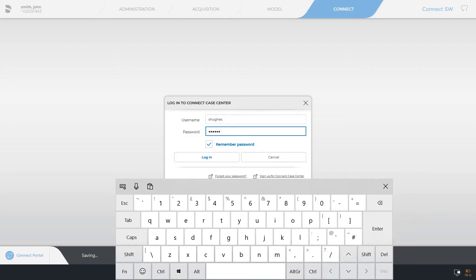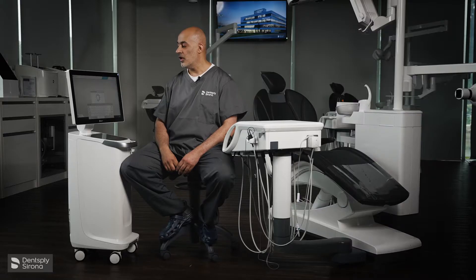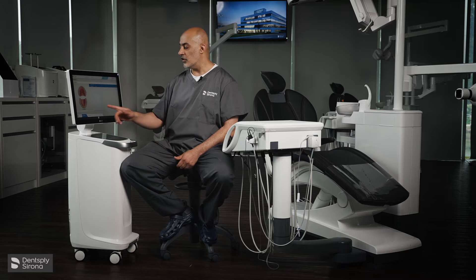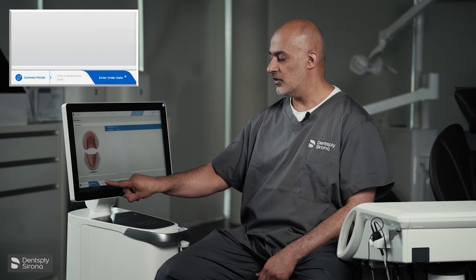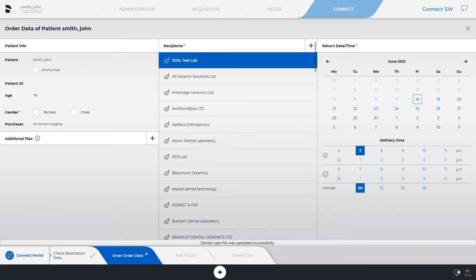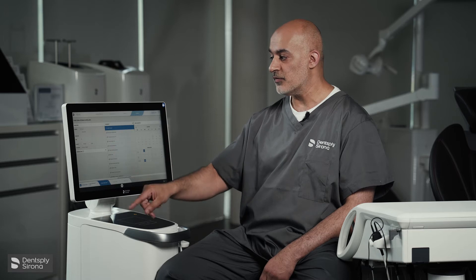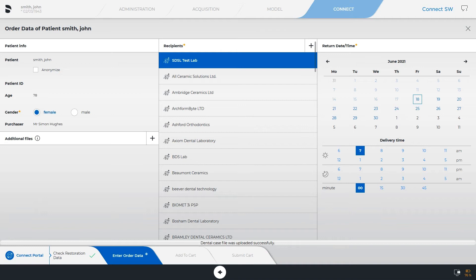The next page is going to upload your scan and you can enter the order details, which is this bottom left order tab. You have the patient details on the left — you can anonymize those details. Importantly, you need to select gender: female or male.